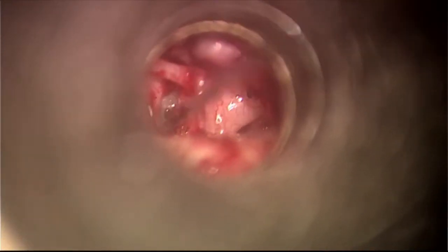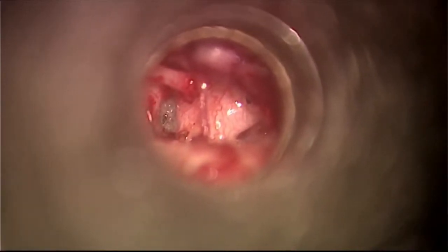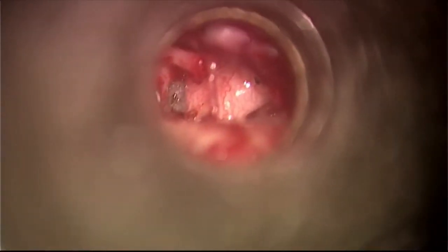See this plate? Now my area of fenestra. Give me first the measuring rod. Just a minute. This looks greater than the previous one to me. More deep. The previous one was 4.25.